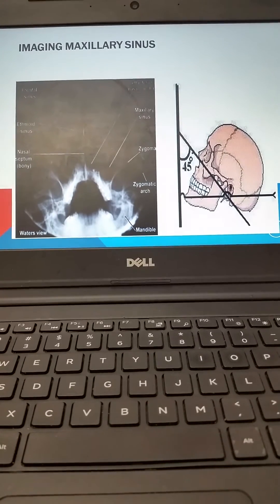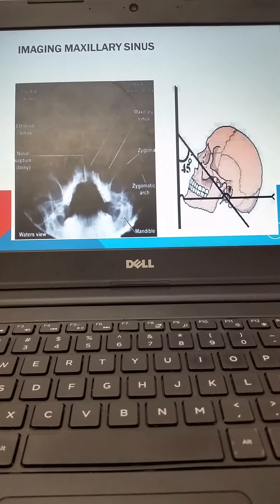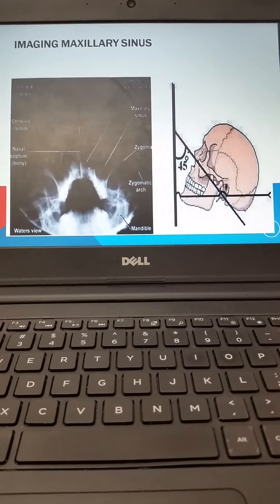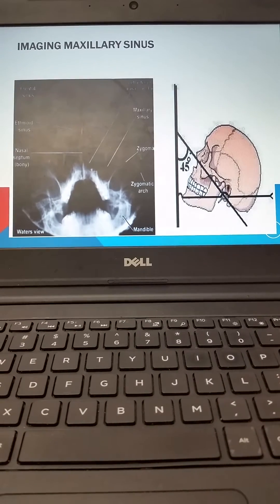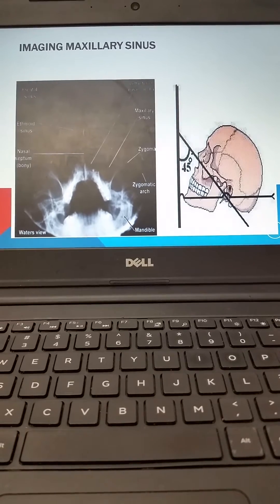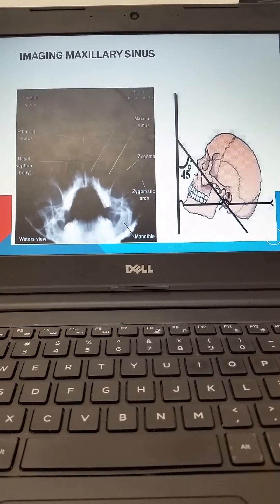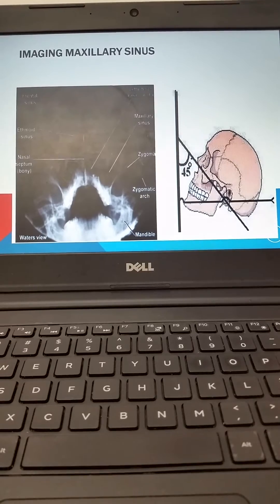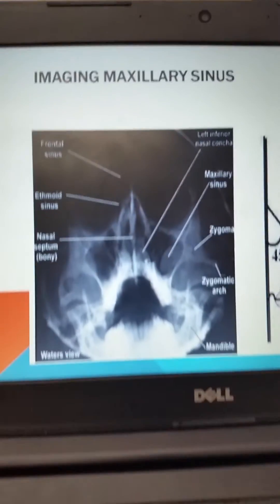Some patients need imaging studies performed when we're thinking about acute sinusitis or other nasal concerns. In these situations, we use what's called a Waters view, which emits ionizing radiation at an angle to allow for better visualization of the internal structures. Notice how the ethmoid sinus, the frontal sinus, and the maxillary sinuses are all visualized in this image.